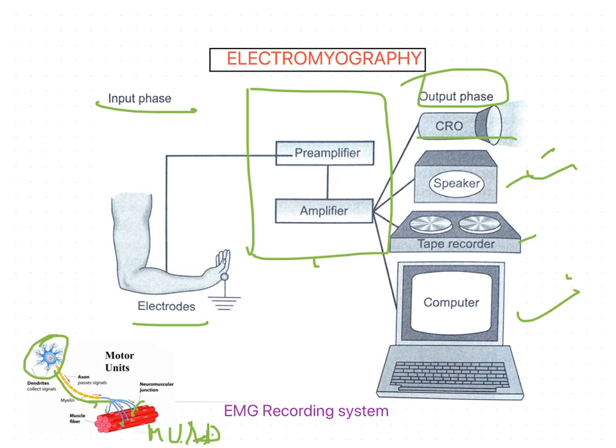Recording is normally made through a coaxial needle electrode. Diagnostic EMG cannot normally be carried out with surface electrodes. When a normal muscle contracts, all the muscle fibers in the motor unit depolarize at the same time, causing a local electrical disturbance in the muscle.